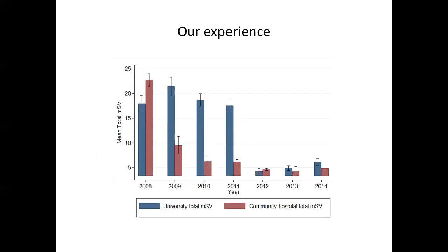So this was some data that I had collected during my fellowship. This is what nationally has happened. This is data from here, Blues University, the other one Southdale. This is in millisieverts. So 2008, that's when radiology used to read them. Are there any radiologists in the room? Okay, because they love to give radiation. So this is when they used to scan, so you can see 20 millisieverts.